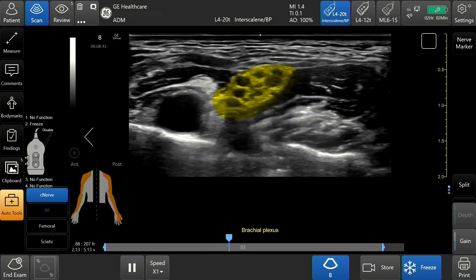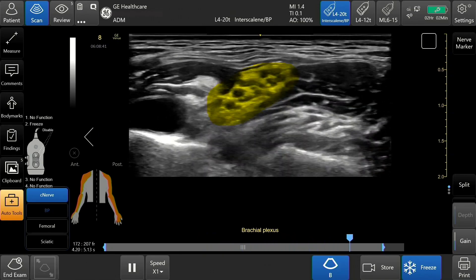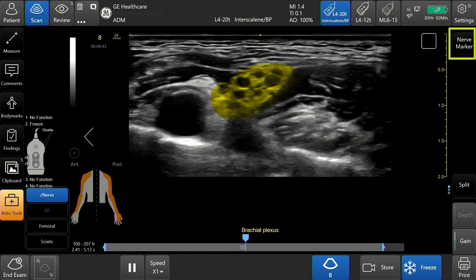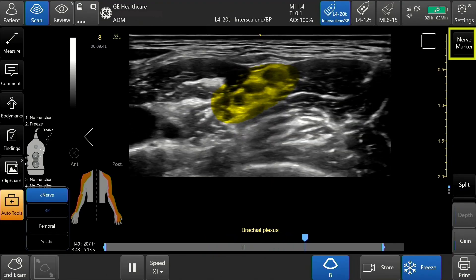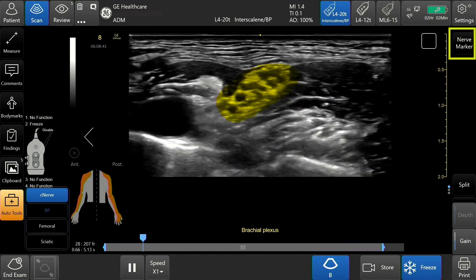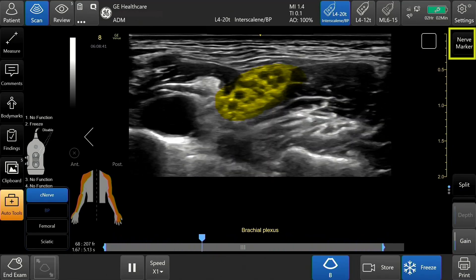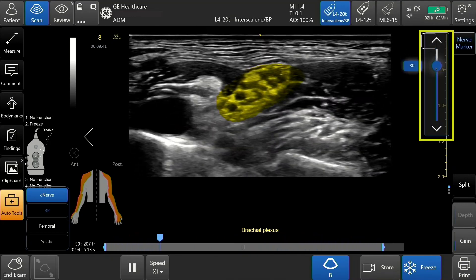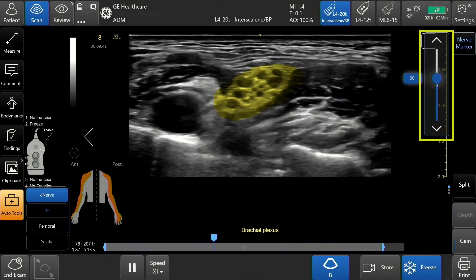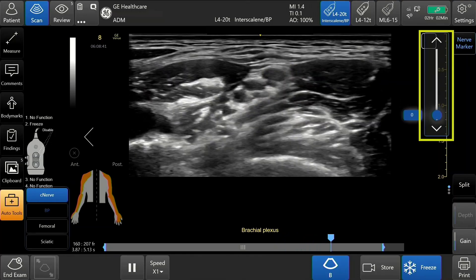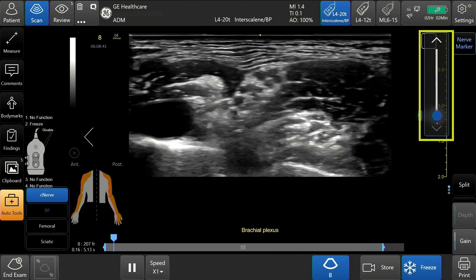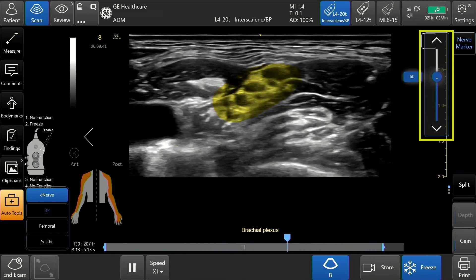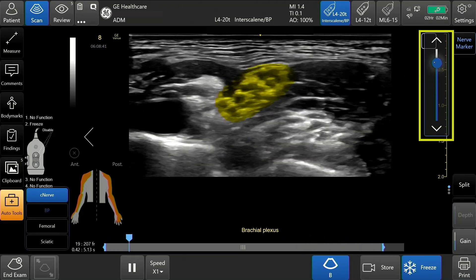The color saturation of the overlay on the nerve can be adjusted using the Nerve Marker button, found at the upper right corner of the screen. Tap Nerve Marker and a slider appears. Minimum saturation renders the yellow overlay indistinguishable from the background, and maximum saturation renders the yellow overlay almost opaque.